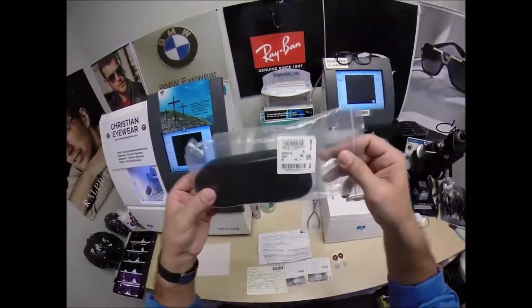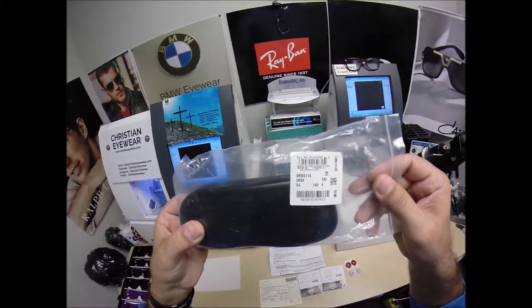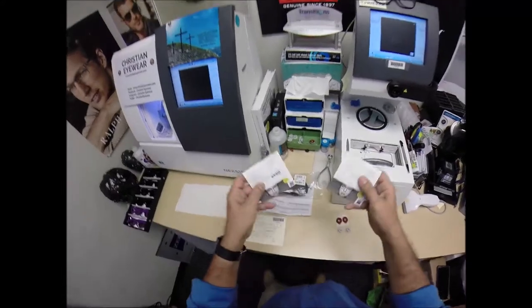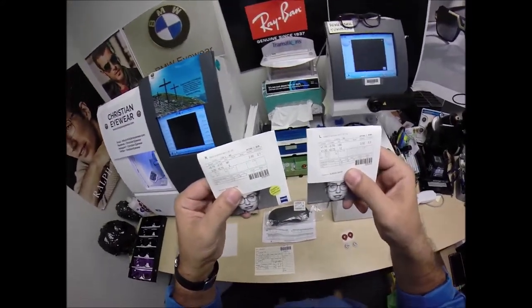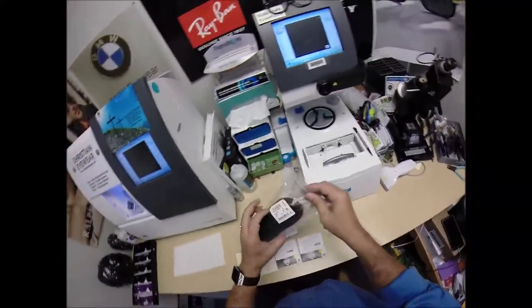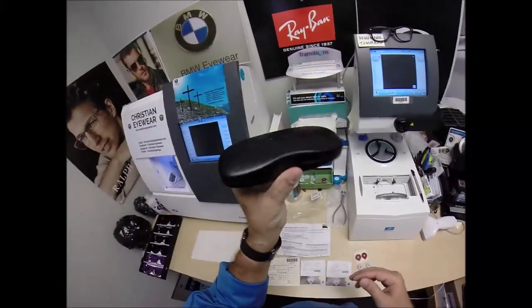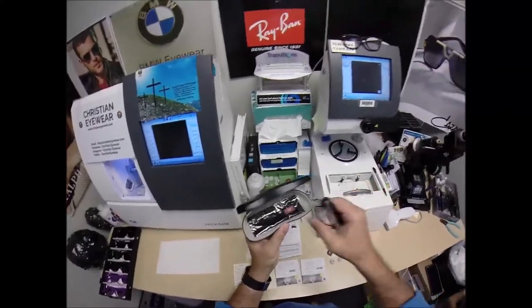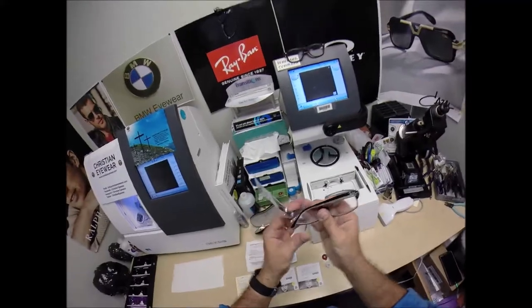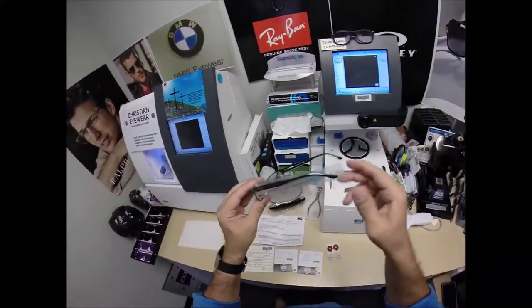That frame is the Ray-Ban 5114, color 2034, which is the classic black and crystal in the 54 eye size. And you're going to get the Zeiss Light D digital free form progressive lens with DuraVision Chrome anti-glare. Let's take out your frame first and take it out of the packaging — your hard shell Ray-Ban case, your Ray-Ban cleaning cloth, and it comes with a little plastic sleeve on the left temple to protect the temples from rubbing together during shipping.